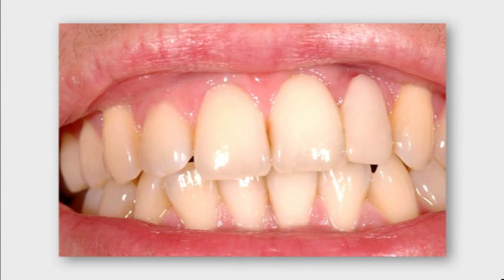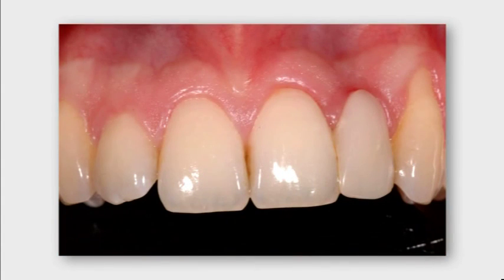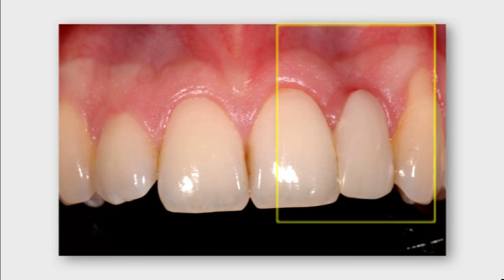This 23-year-old female patient has a medium smile line and an adhesive bridge to replace a congenitally missing left lateral incisor in the maxilla. The adhesive bridge suffered recurrent loss of retention. Thus, it was decided to evaluate the local anatomy for an endosseous implant to allow an implant-supported single crown.